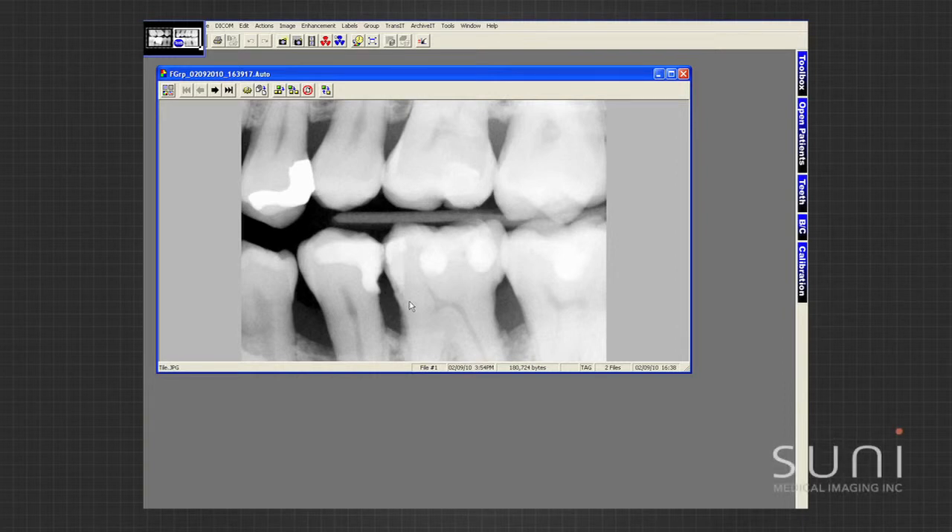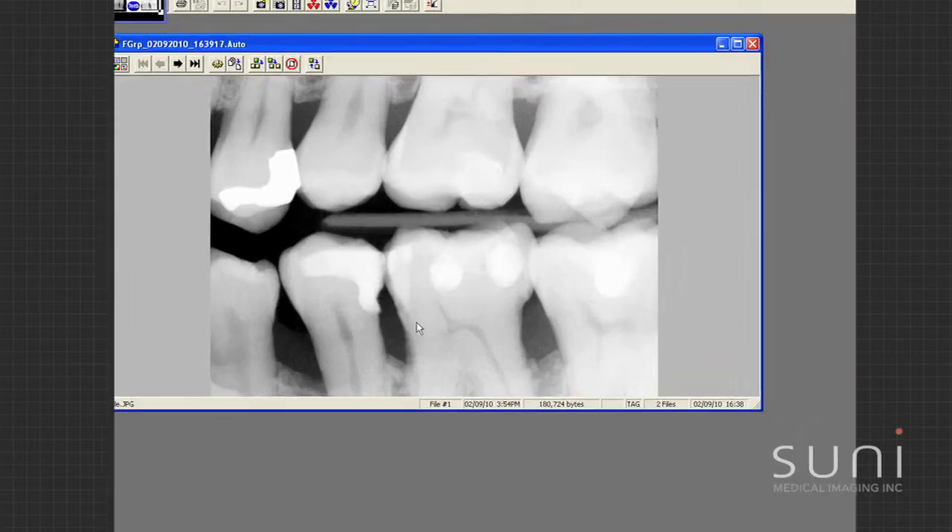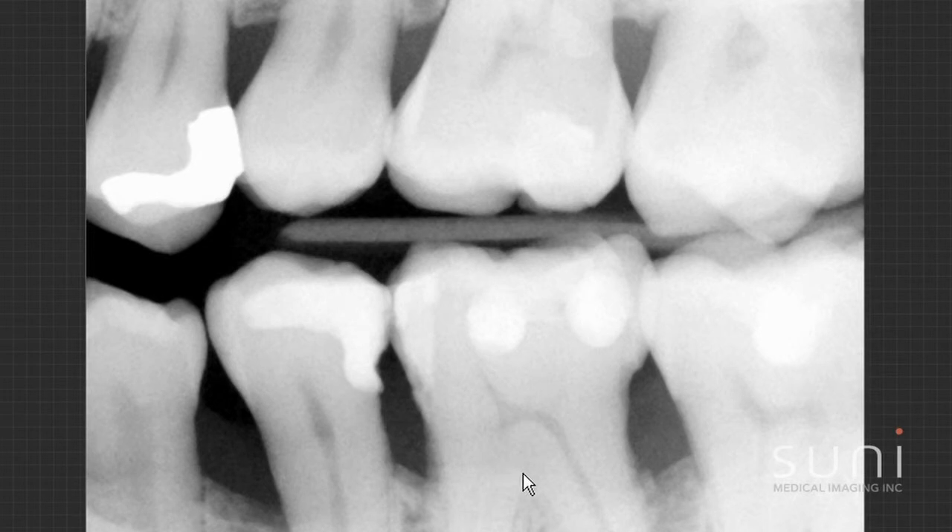This is case number one bite wings, and what I like with the Suni — you can see how clear that is. I can see really good detail. Obviously we're always looking for interproximal decay. I can see really good detail; I can see where he has some bone loss.